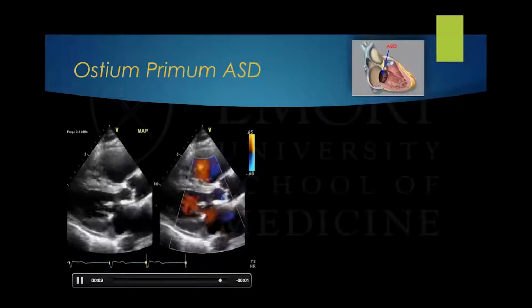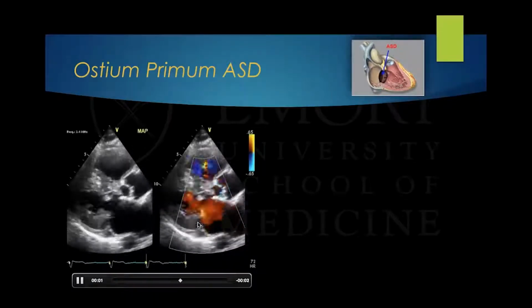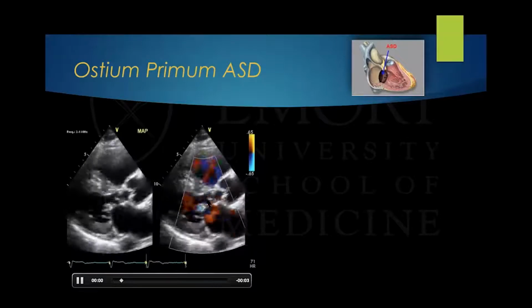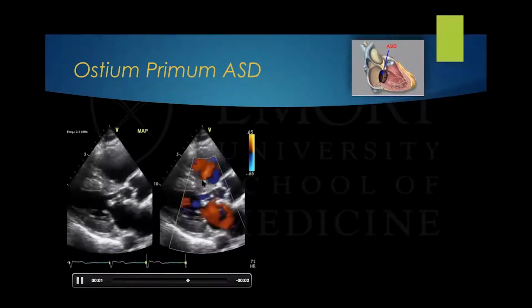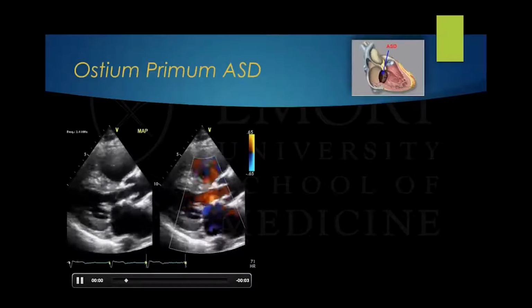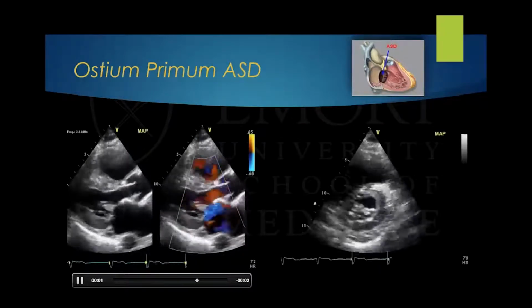In the parasternal long axis view, you can appreciate that the mitral valve appears to be thickened, and there are some cords attached to the ventricular septum. The right ventricle appears to be dilated, and there is some degree of regurgitation due to the cleft mitral valve associated with this type of lesion.